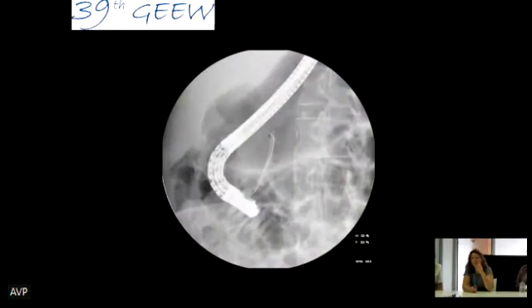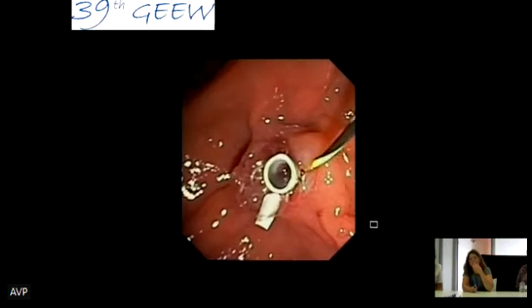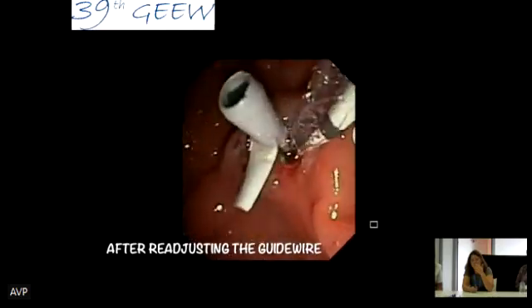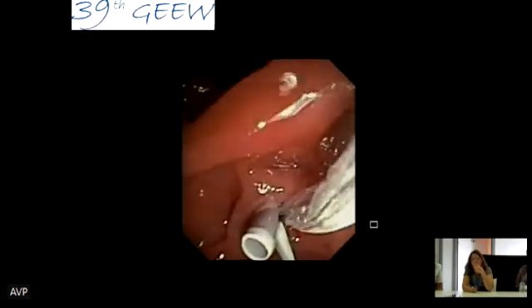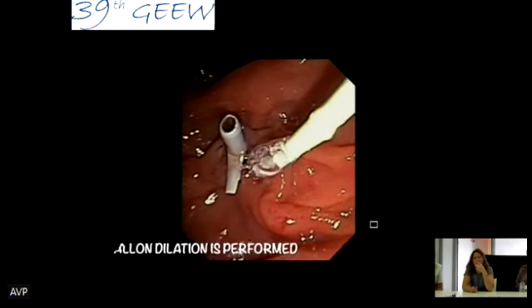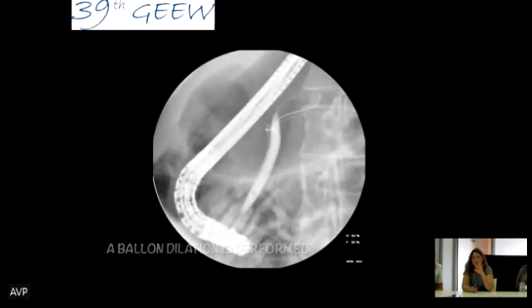Yeah. And then we are ready to put the next stent, which we'll now put in a long position. The last one, yes. And here we will dilate before, just to be sure that there's not going to be any migration. Dilate beside. Here, the nightmare is always when your stent has migrated inside.